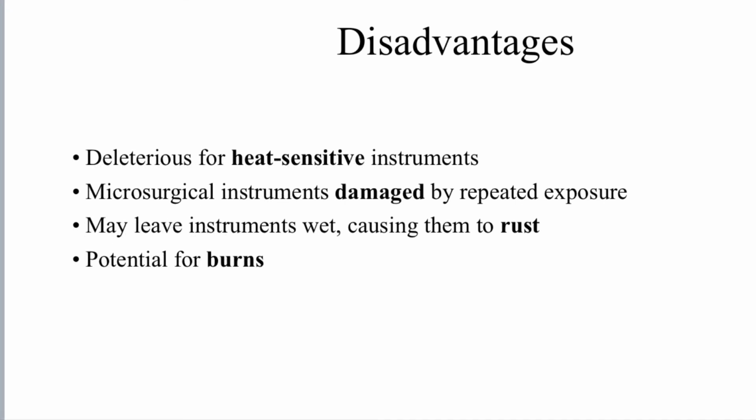Disadvantages: deleterious for heat-sensitive instruments. Microsurgical instruments may be damaged by repeated exposure. May leave instruments wet, causing them to rust. Potential for burns.